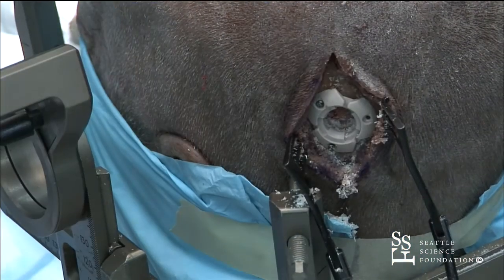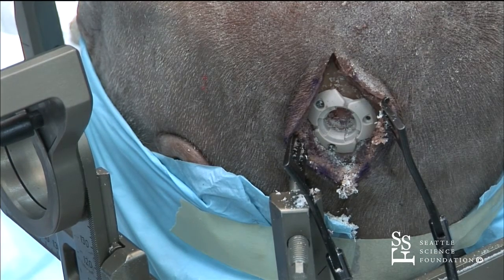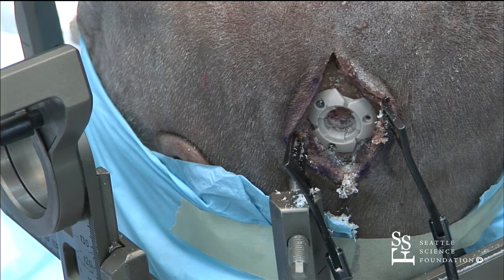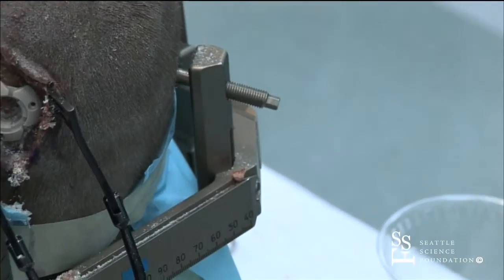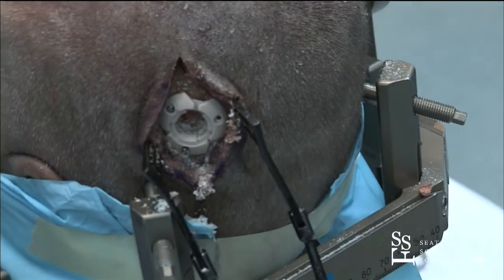And so if you're going to be using the 44-centimeter electrode, do we have the measuring device? Yeah. So I'll just use the same measuring device as we use for DBS. This makes it easier to get the length of your electrode.